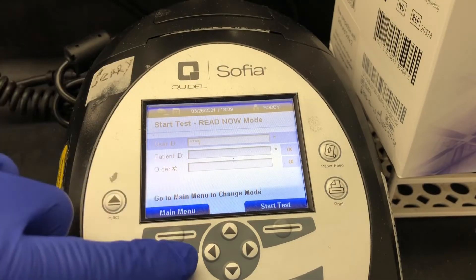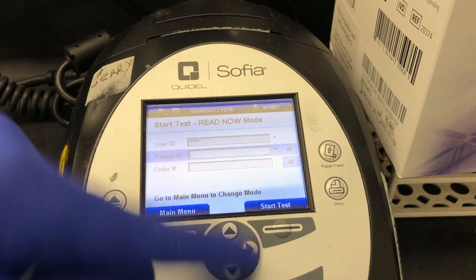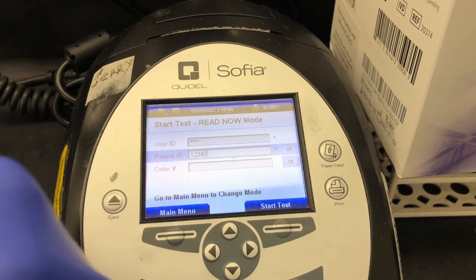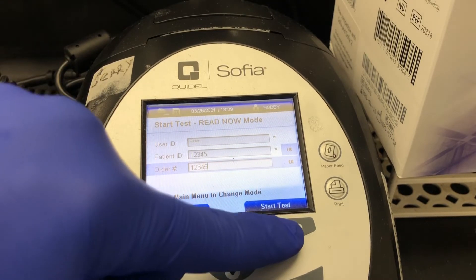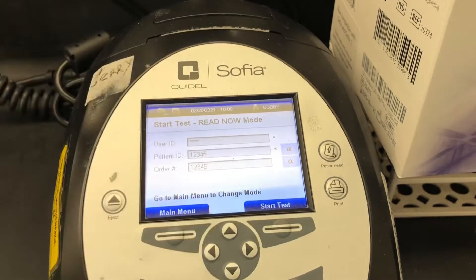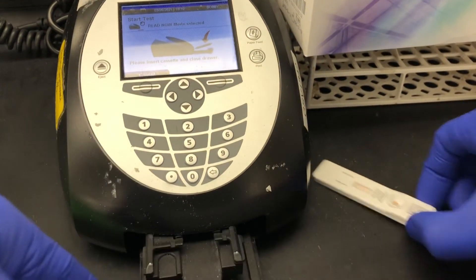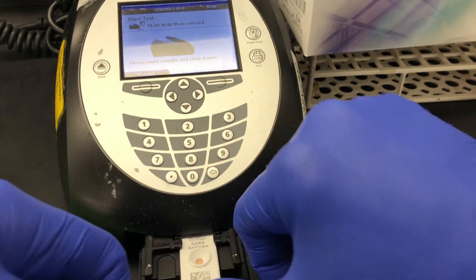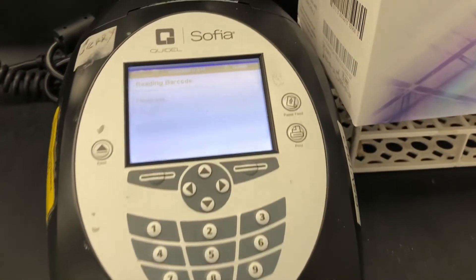After those 15 minutes, I'm going to run this as a patient, not a QC. You want to enter in your user ID, then enter a patient ID and a patient order number. Once you have those in, press start test and the little drawer will pop out. Then go ahead and place the test cassette in.